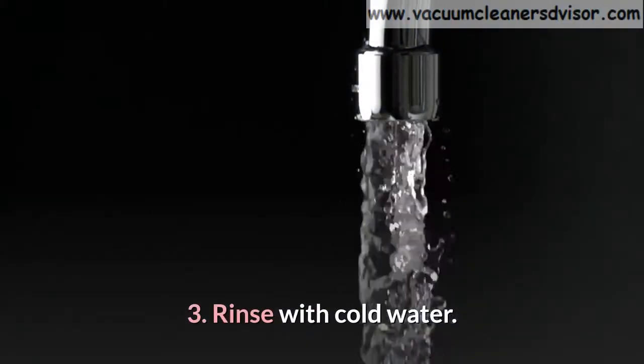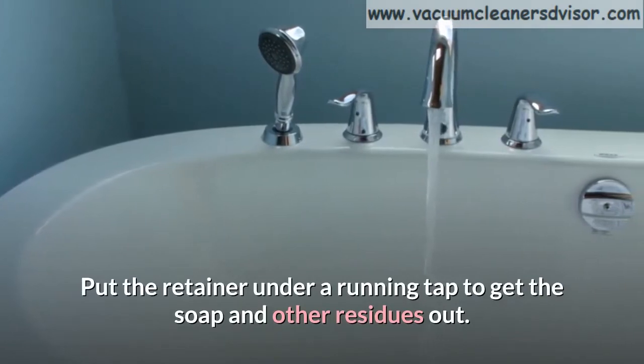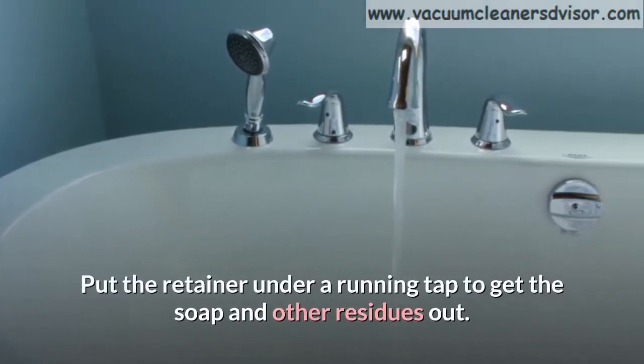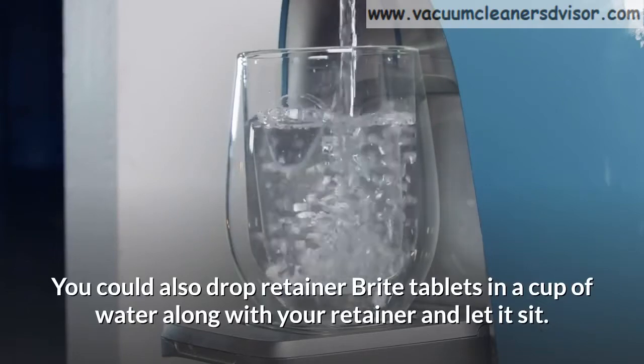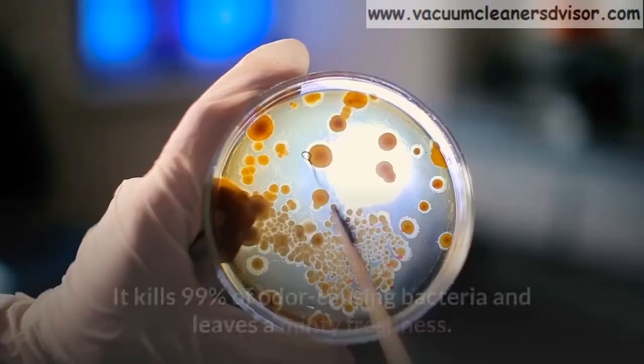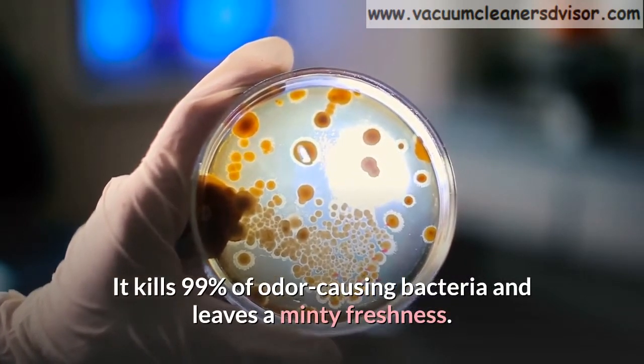Step 3: Rinse with cold water. Put the retainer under a running tap to get the soap and other residues out. You could also drop retainer bright tablets in a cup of water along with your retainer and let it sit. It kills 99% of odor-causing bacteria and leaves a minty freshness.